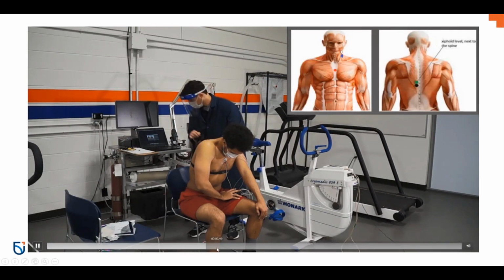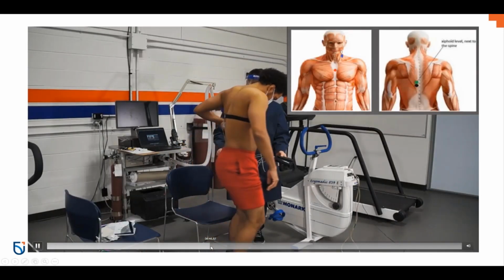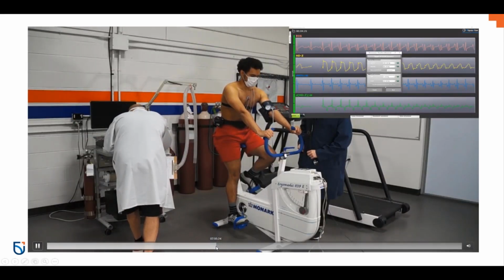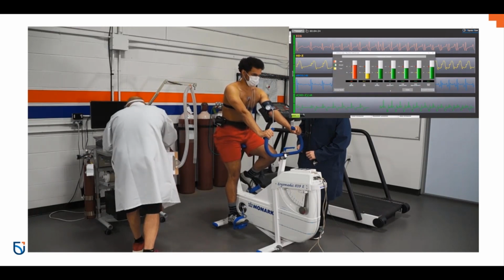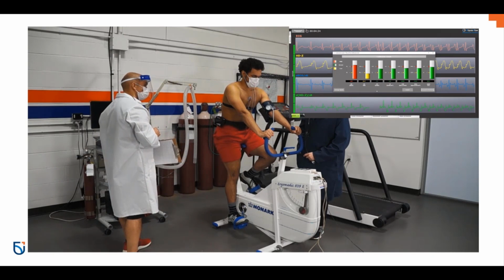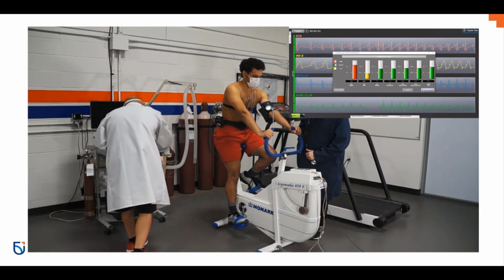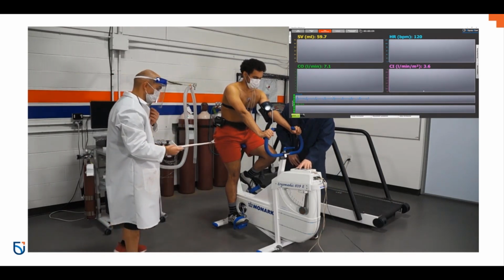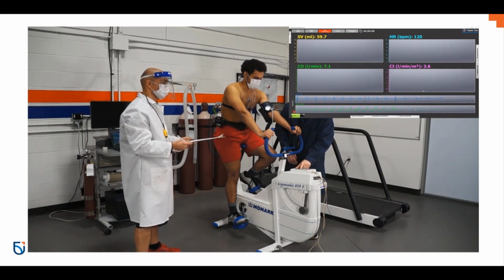Okay, we'll continue that video, and I believe, yeah, so we get the participant up. Sort of show you quickly, but you already know what that looks like. They can pop their shirt back on here if you'd like, but it does get a little bit cumbersome, and if they're comfortable, I like to see that the electrodes aren't falling off, especially if we have high impedances. We had semi-high impedance on one of them, but what it did show was that this participant had a fairly high resting heart rate.